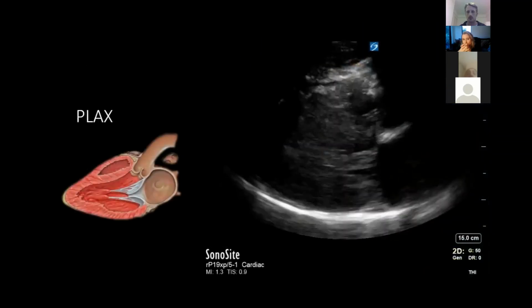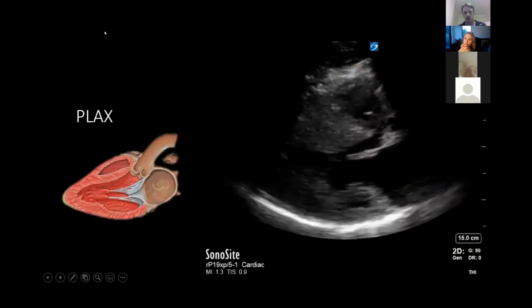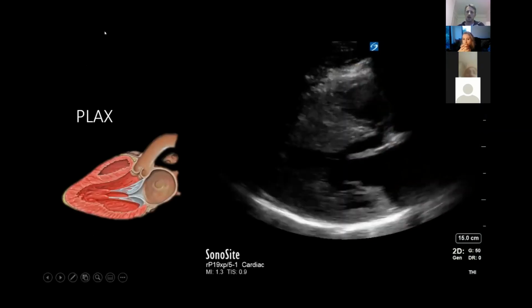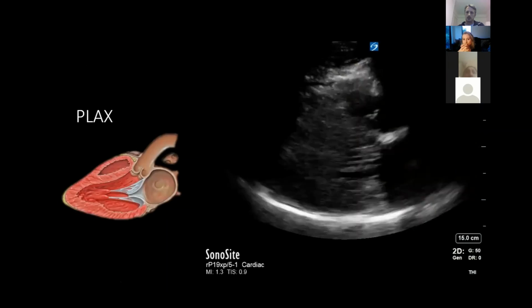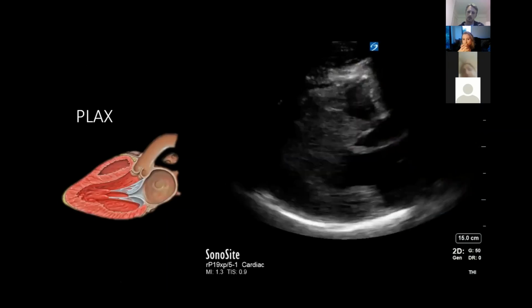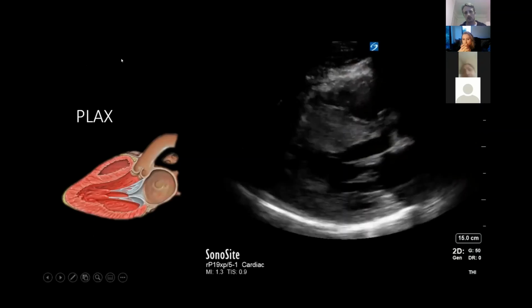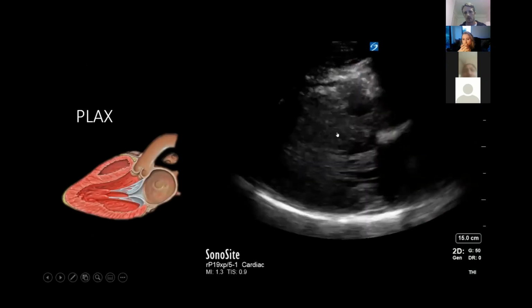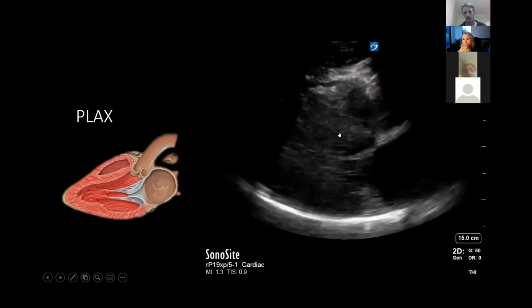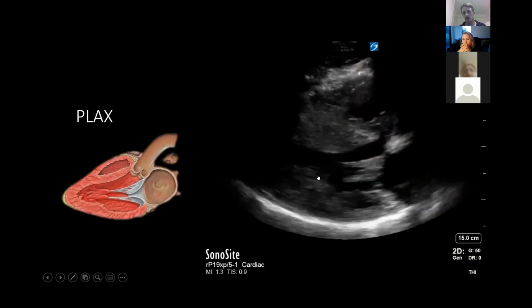So we quickly do. And this was Banaz, the ultrasound lead at the Royal London. Have a quick look at that echo and see if you can see the obvious abnormalities and anything slightly less obvious. I think what you can see here is that the interventricular septum and the posterior left ventricular wall are really quite thick.